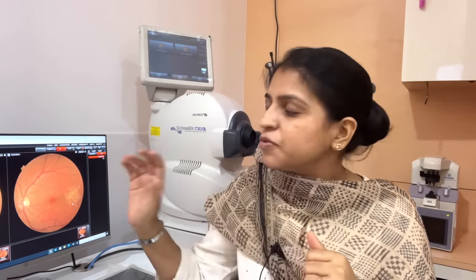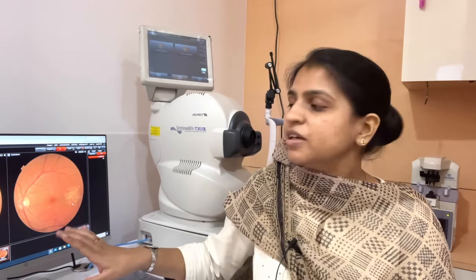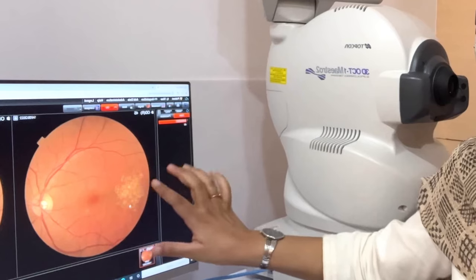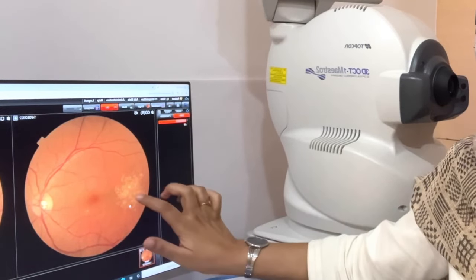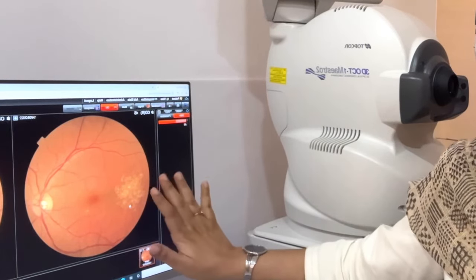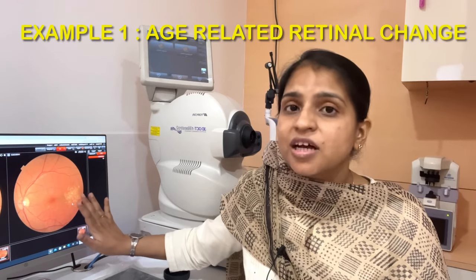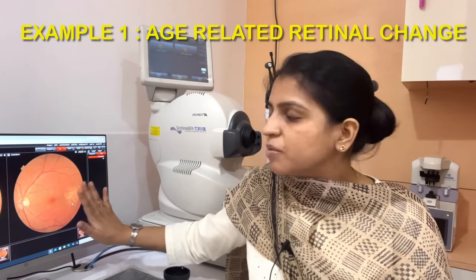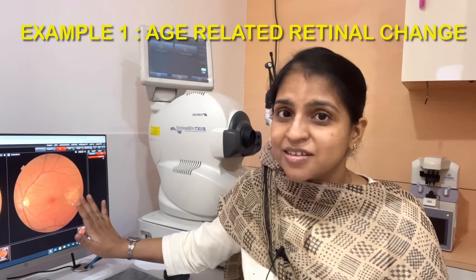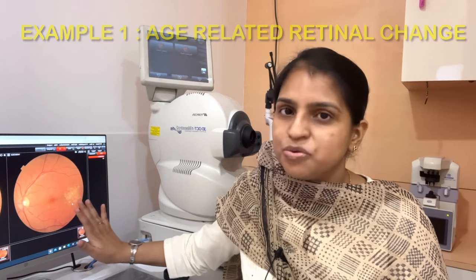For those results, we advise fundus photos. As you can see here, this spot is not a normal spot. There are age-related changes on the retina. This will be easy for you to understand because we were looking at the machine but now you need to look at the image.